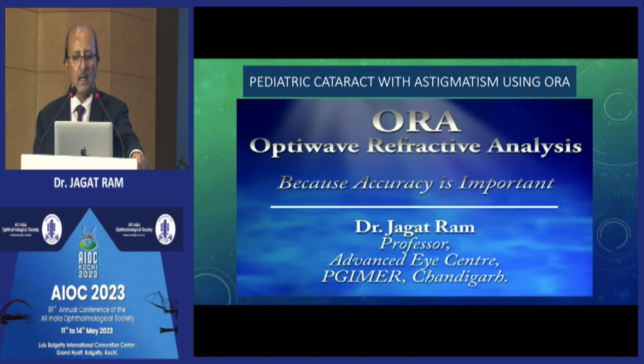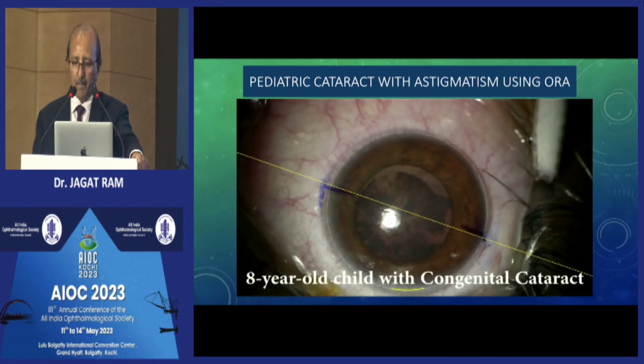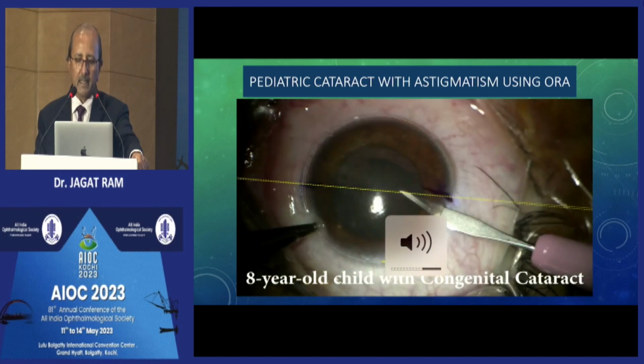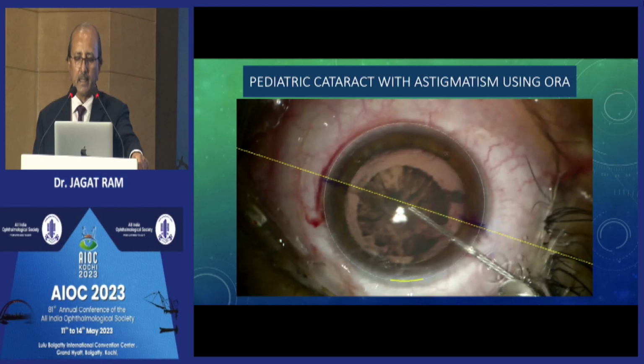This is another small video. This is in a pediatric cataract. It is a classical zonular cataract.